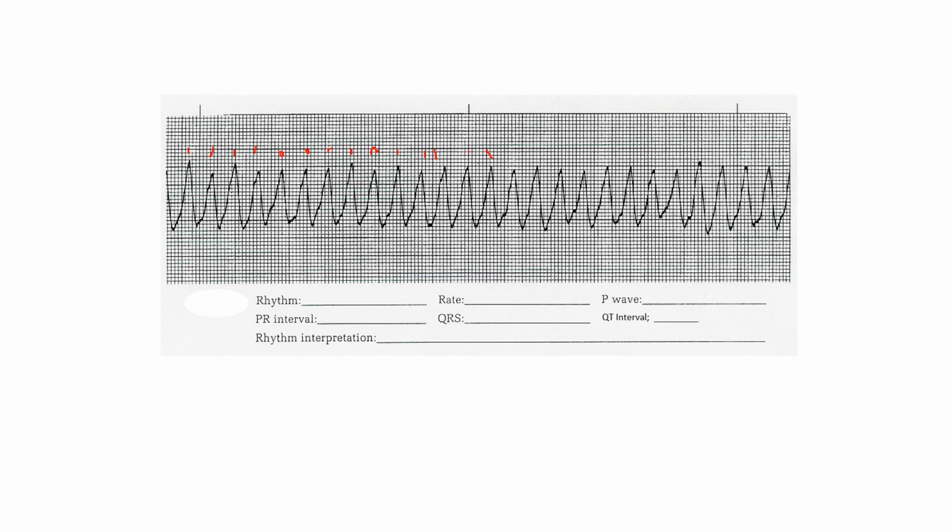So when you synchronize cardiovert, what you're doing is you're delivering that energy, and it identifies where the R wave is. Always make sure that before you deliver the shock, you clear the patient and use safe electrical safety.